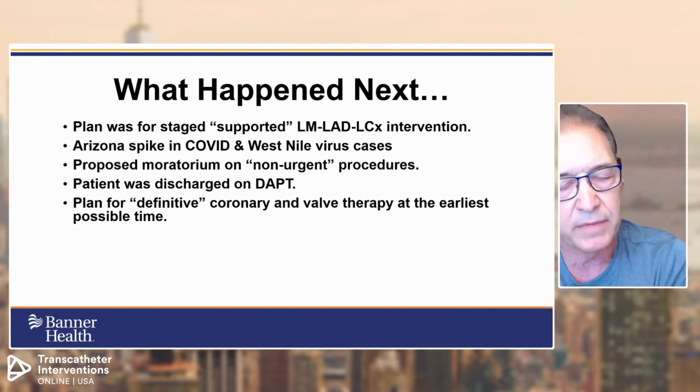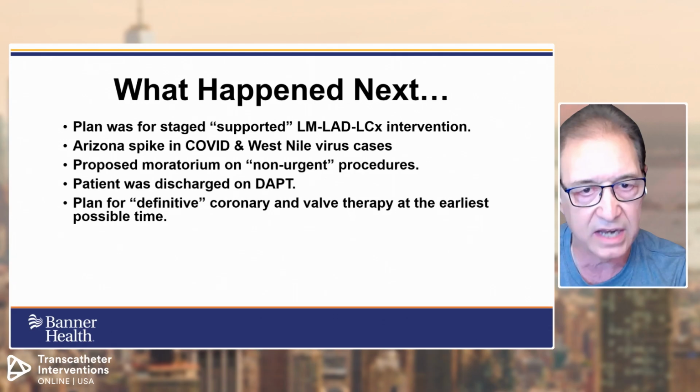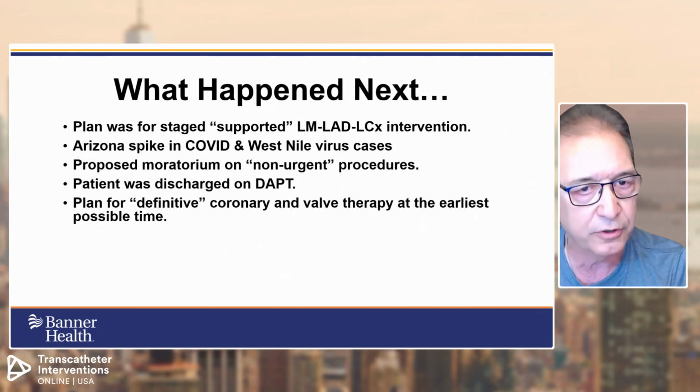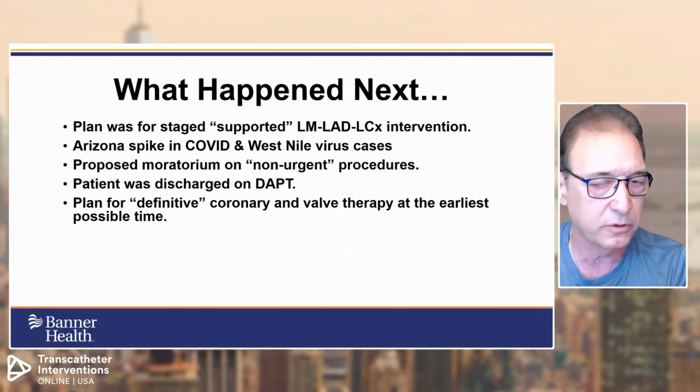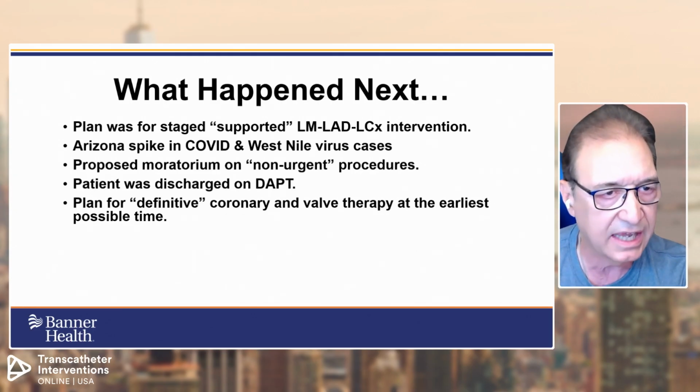The one thing I didn't mention is each time we did passes with our rotational atherectomy device, she bradied down and she got hypotensive. In fact, there was a rather protracted amount of hypotension after each pass, which we were able to treat medically in the cath lab.